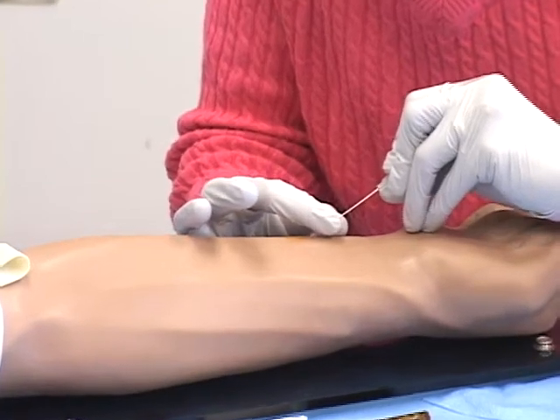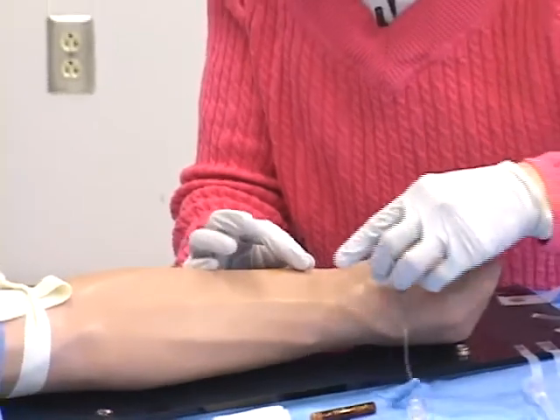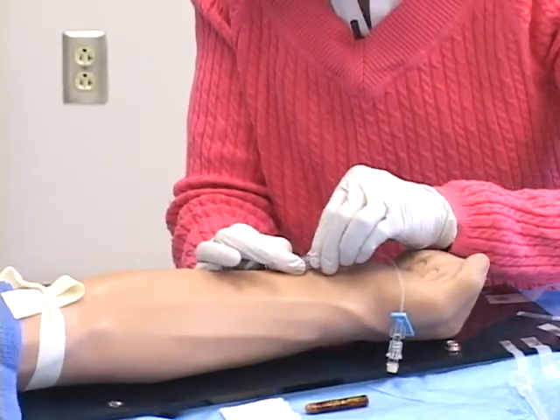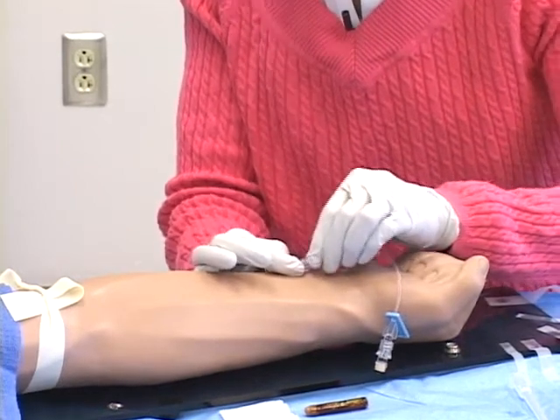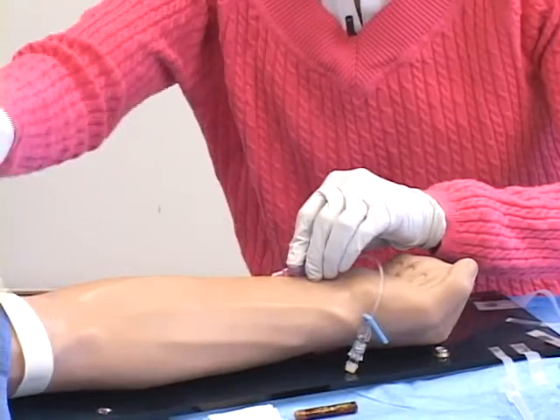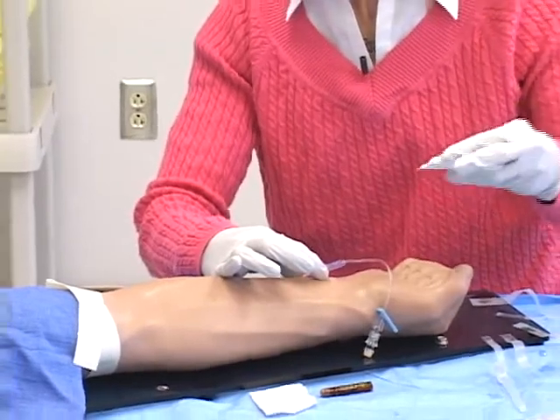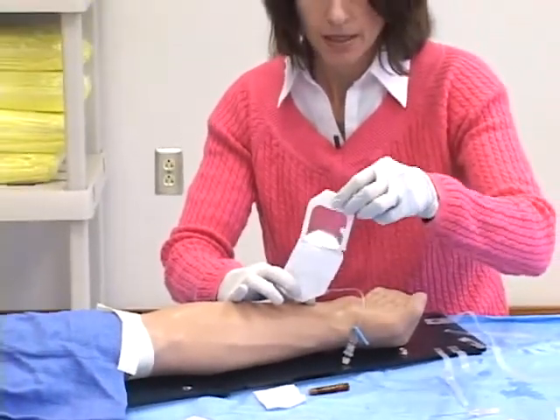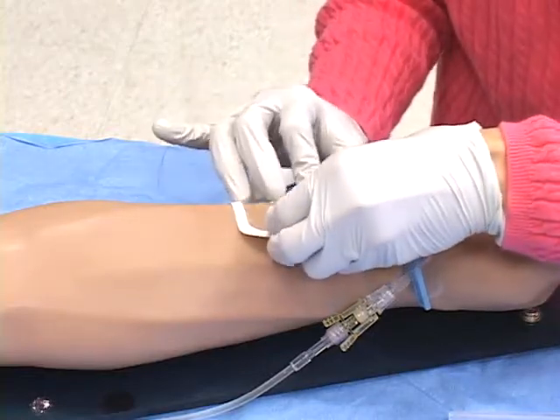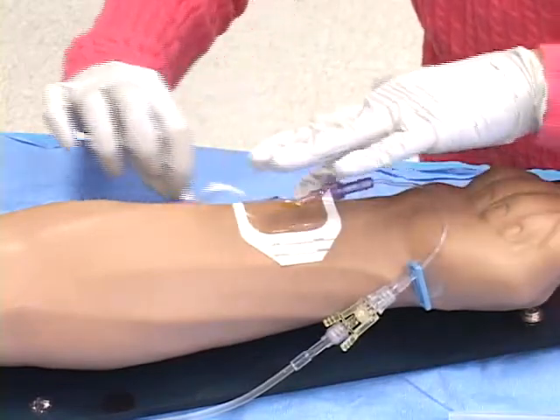And you put the catheter flush with the skin. You're going to remove the stylet, and you're going to have this flashback. It helps if you apply pressure peripherally so you don't leak out as much blood. You screw on the connector cap, and you can go ahead and remove the tourniquet. Once you have this in place, you're going to go ahead and take your Tegaderm, and you're going to apply it at the distal part of the catheter to make sure this is secure.